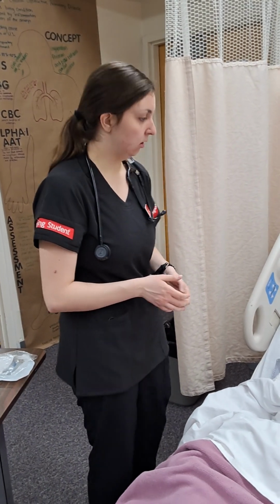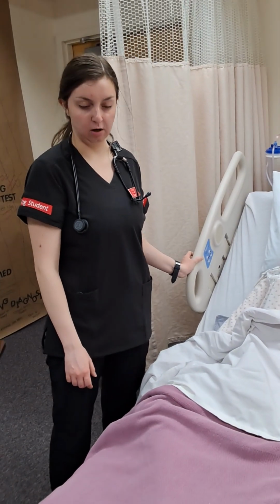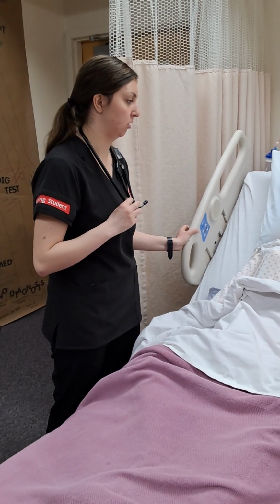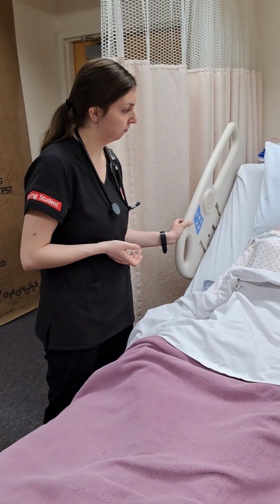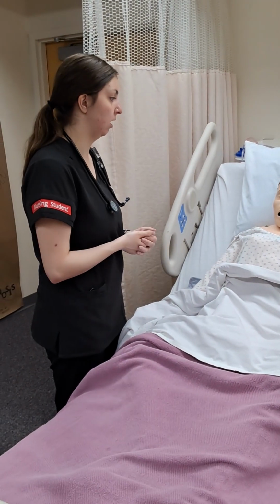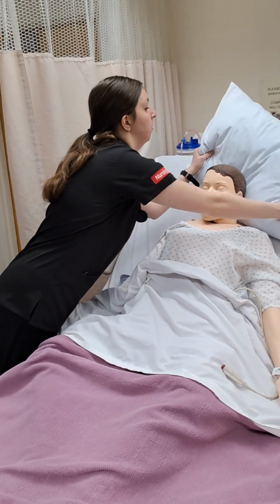No? Okay. So I am going to perform a respiratory and a GI assessment on him. Is it okay if I lift up your gown and touch my stethoscope to your bare skin so I can listen to you? Yeah? Okay. I'm going to do your anterior, your front lung sounds first. I'm going to take this pillow from you.